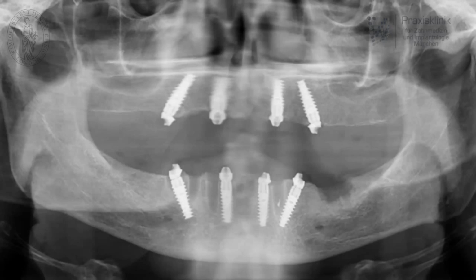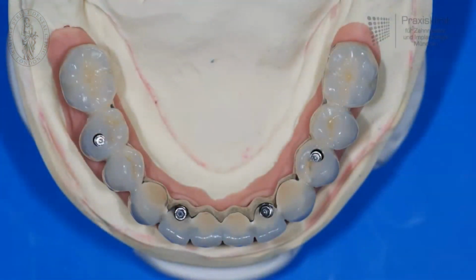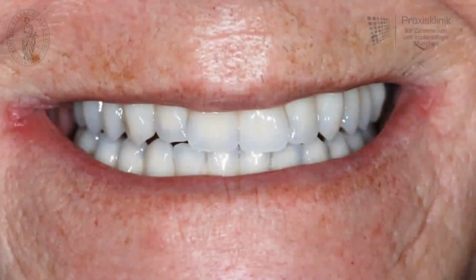Having a very exact implant position with regard to the definitive restoration, it is very easy for the dental technician to finalize this restoration. Here in the last X-ray image we can see we have 2 screw-retained bridges in the upper and the lower jaw, and the intraoral situation looks very nice and aesthetic. So even the last picture showing the smile of the patient is very satisfying.